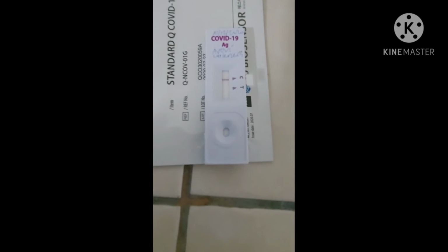Now in this case, if the T is marked, it means that it is positive for COVID-19 antigens, and if it's negative, it means that the antigens are not present in the nasopharynx, which is where we took the sample from. Now, it's important for us to know that the antigen test shows the presence of the certain proteins of the virus, right?